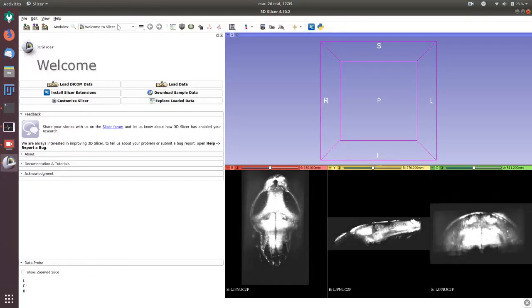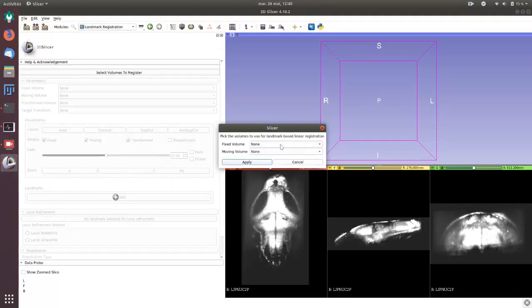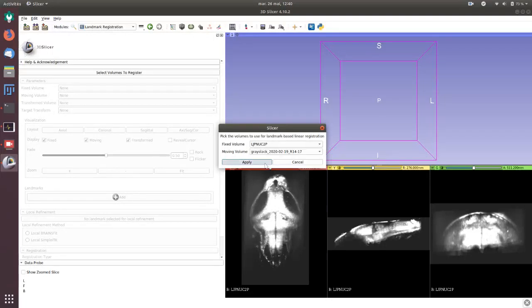The action we want to perform is a registration, landmark registration, with as a fixed volume the reference brain and as moving the gray stack.